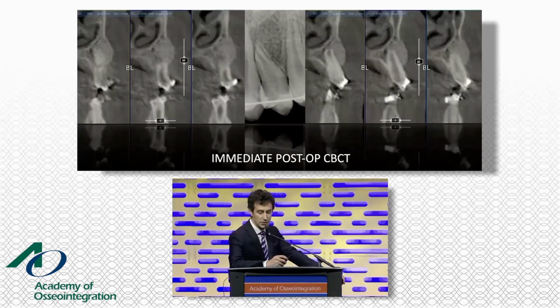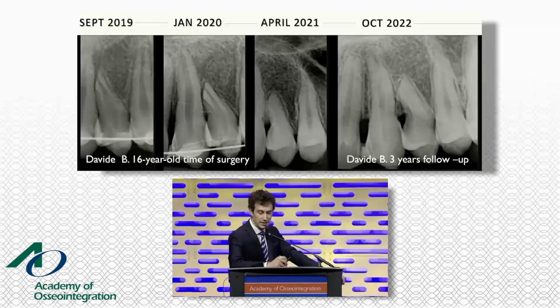And this is the storytelling about Davide, starting from September 2019, January 2020, April 2021, and three years of follow-up in October 2022. We can see the correct apicification of the canine and the preservation of the periodontal ligament on both teeth.